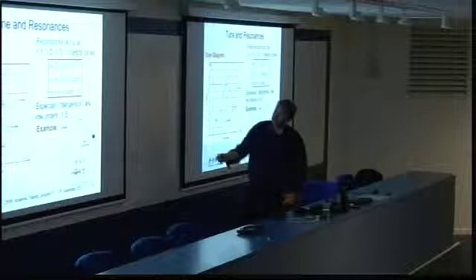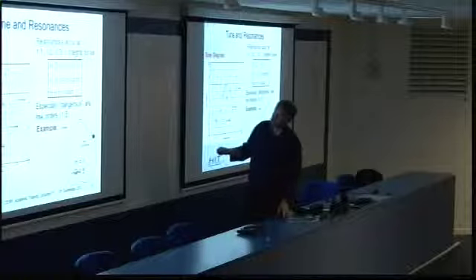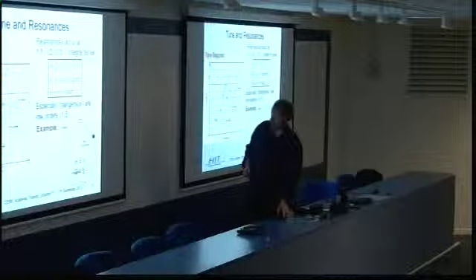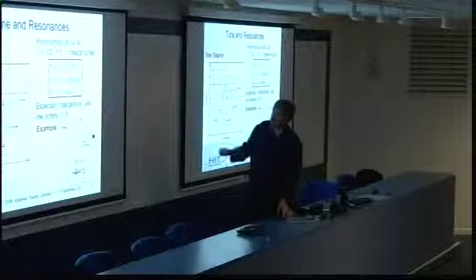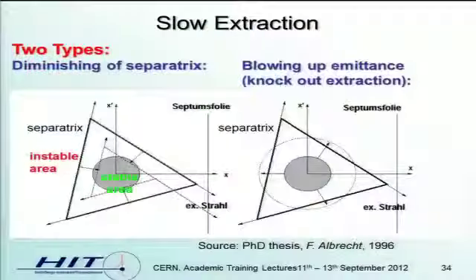And well, this is shown in the tune diagram which we use for carbon, helium, and proton. If you want to cross these dangerous low-order resonances, then you have to do it very fast. Okay, so for this slow extraction, you can do that in two different methods, or maybe there are some others, but these are the typical ones.